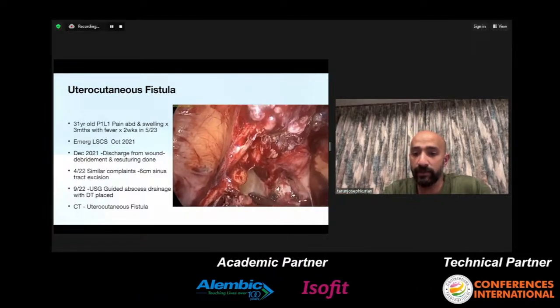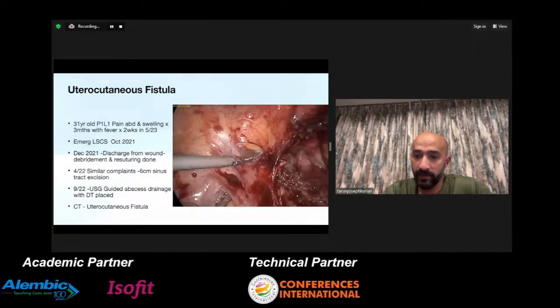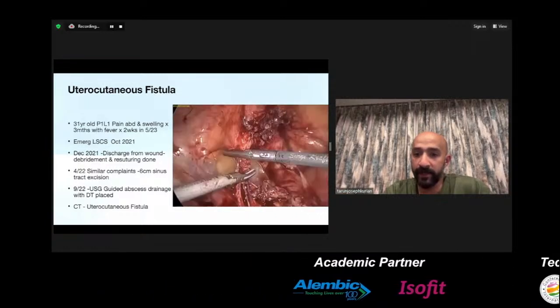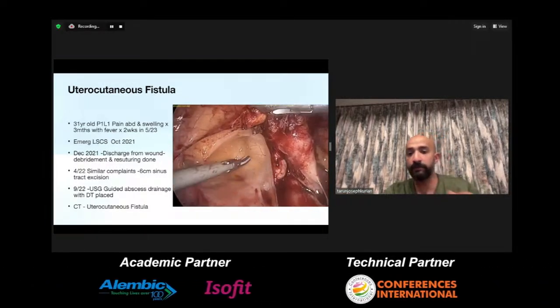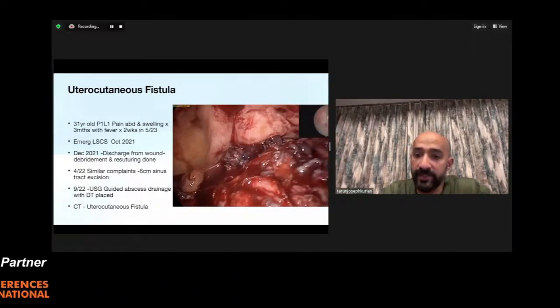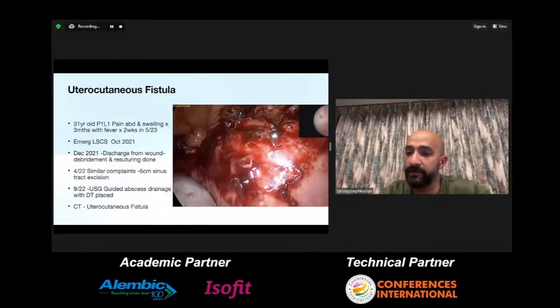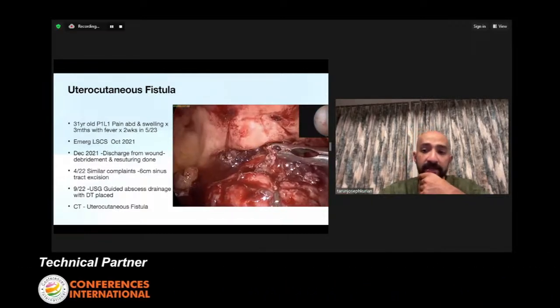So again, dissection was quite easy here. So once I know that it's a peritoneal pouch, it makes my work a whole lot easier. So that's a nice peritoneal pouch developed over there. And there, if you can see just over there, you can see my hysteroscopic grasper coming through, showing us the exact point of where the fistulous tract is.